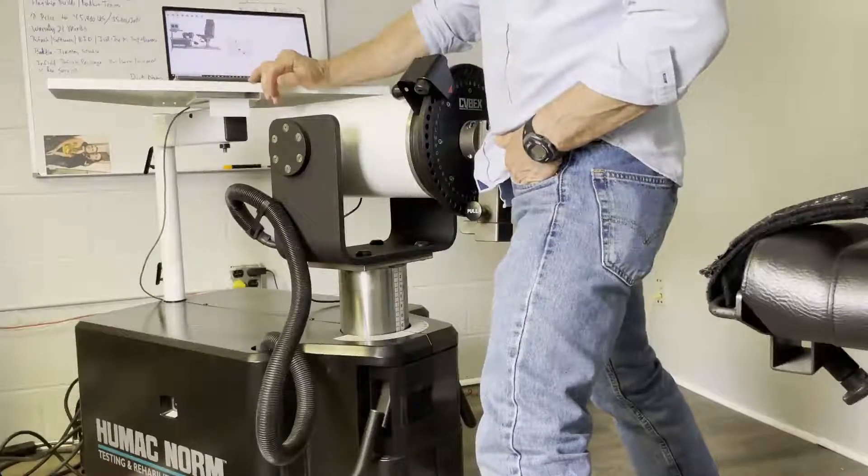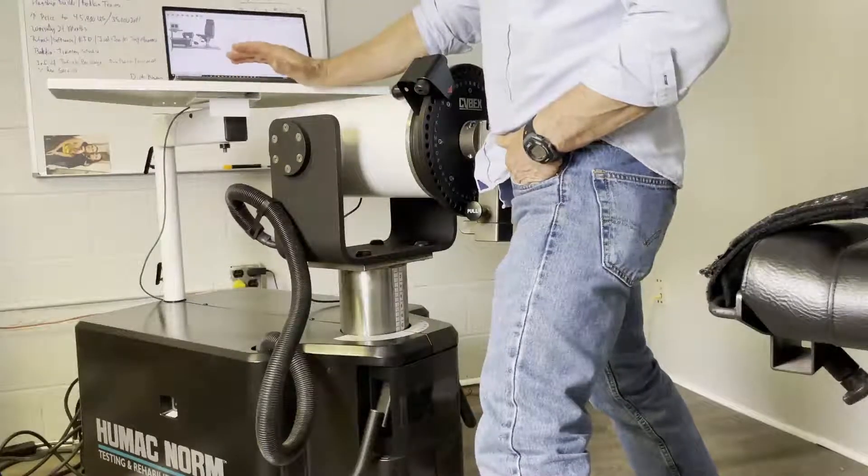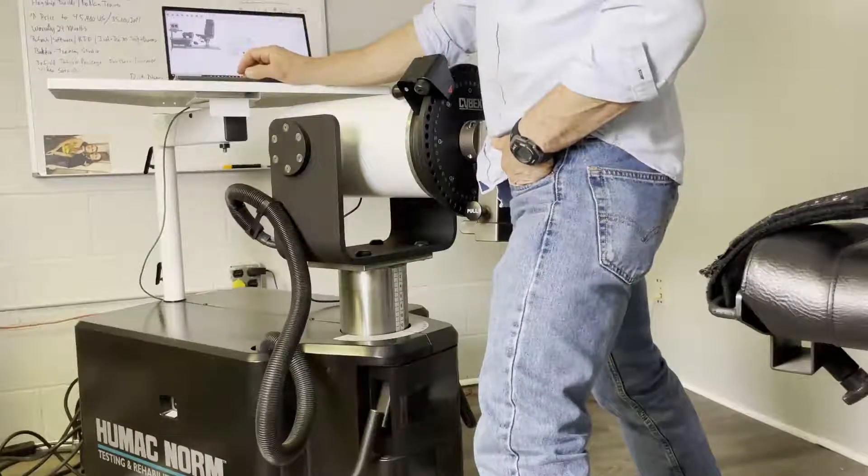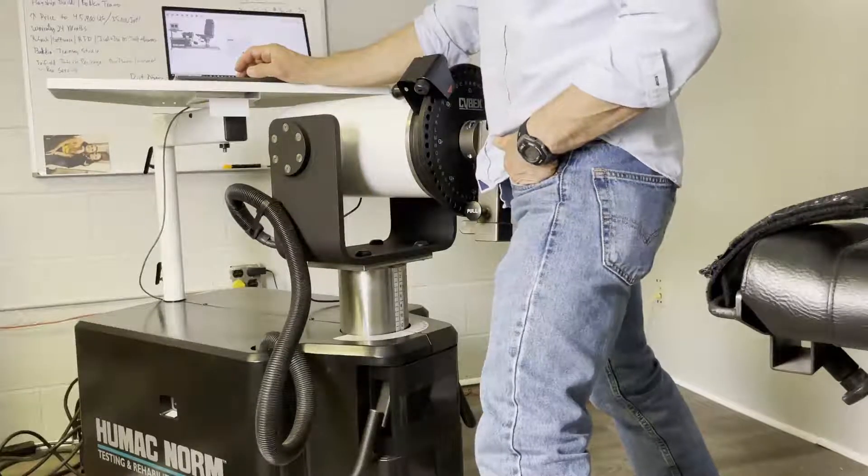If there are Cybex calibration weights and there are no numbers written on the side with a marker, you're all set. To begin calibration, pull down the menu at the top and pick the name of the person doing the calibration.